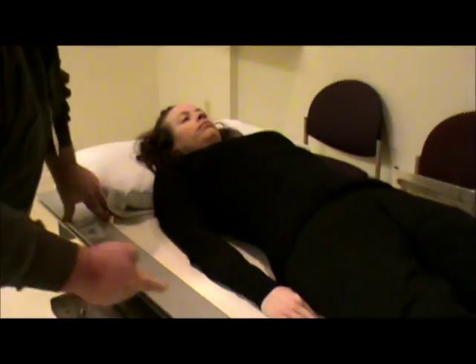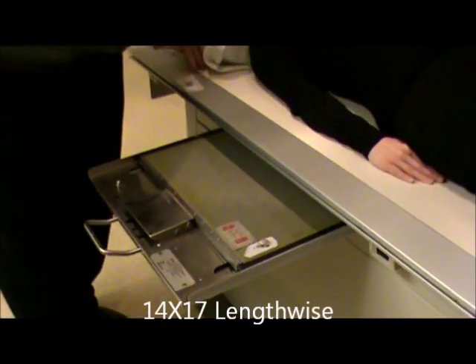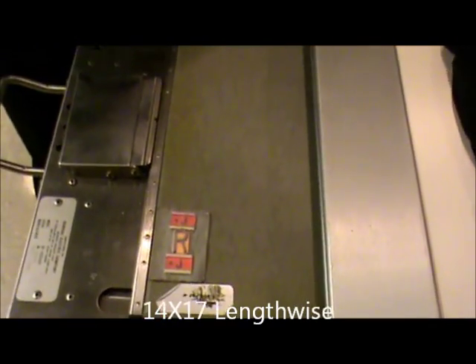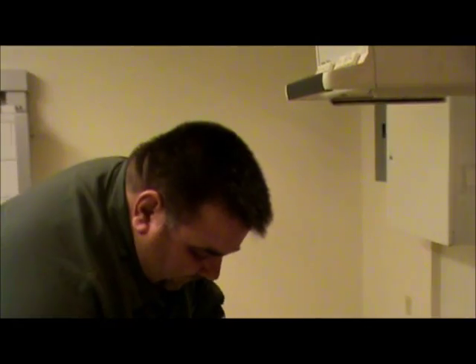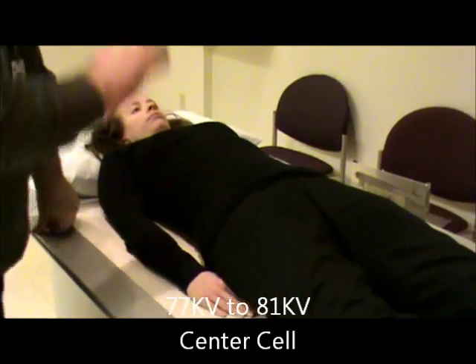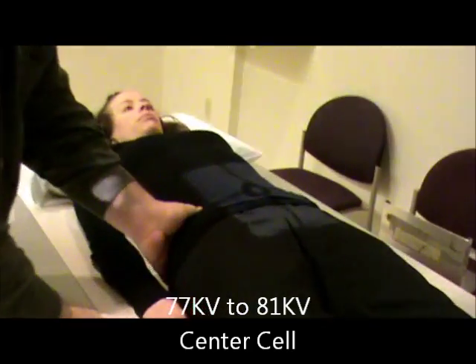We are going to demonstrate a KUB, which is what we'll do as the scout film. As you've learned previously, we use a 14 by 17 lengthwise. Our technique will be 77 to 81 kV, center cell. We've got the film in, we are center-locked and centered to our film.